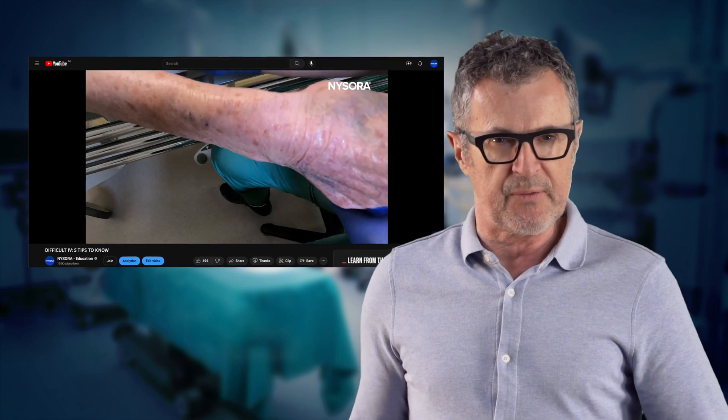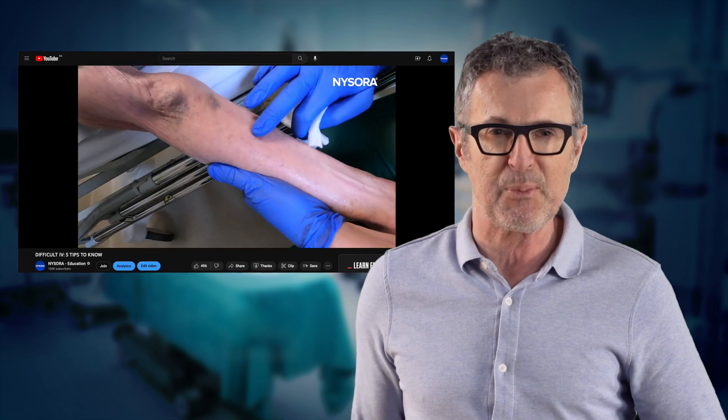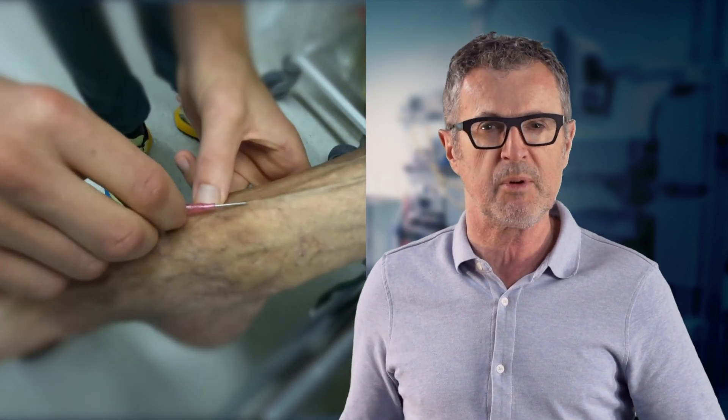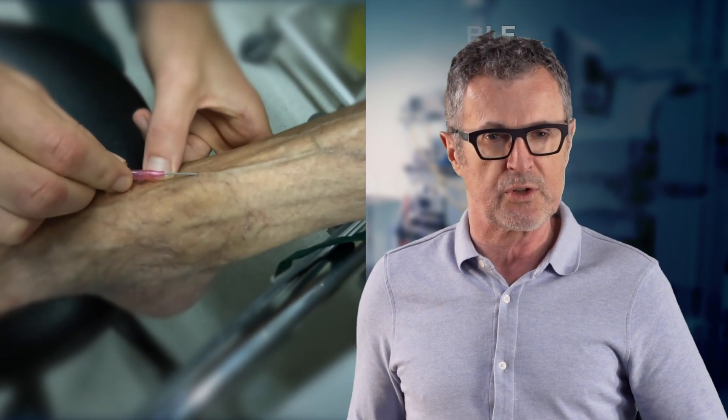Last week we featured a video of a difficult vein access in an elderly patient, where we used a reverse Esmarch technique to enhance the peripheral veins, cannulate the vein, and save the day. But in this video I will demonstrate common mistakes that are often made when an IV must be started in the foot.